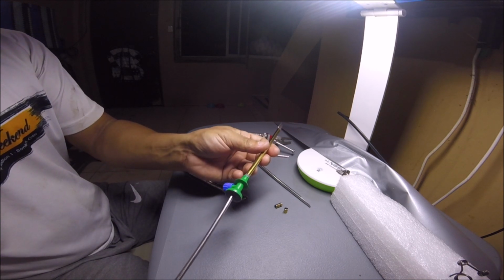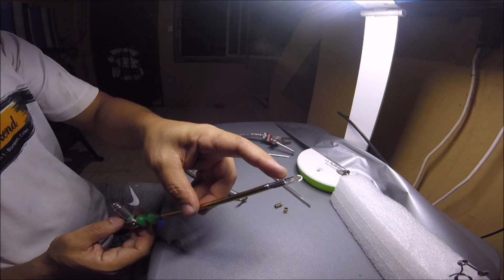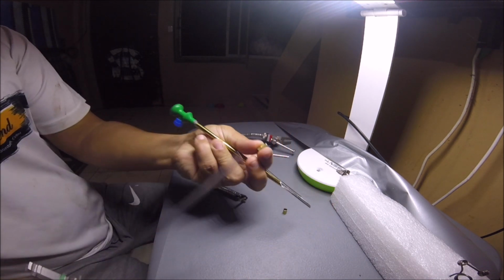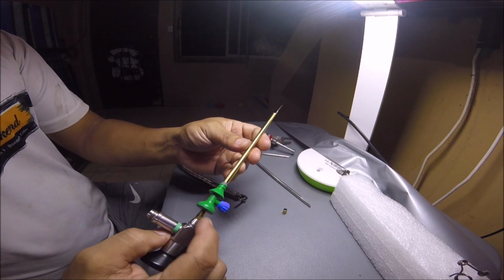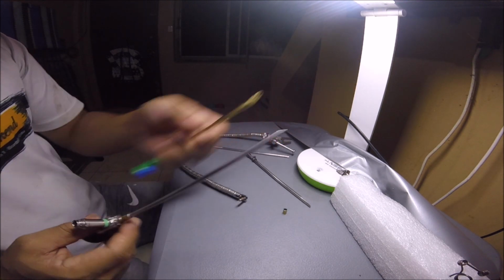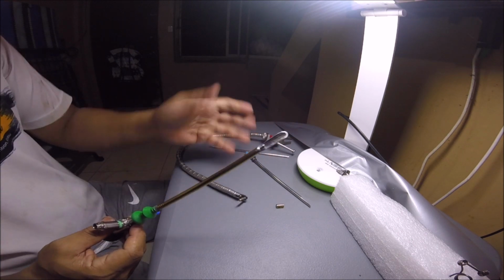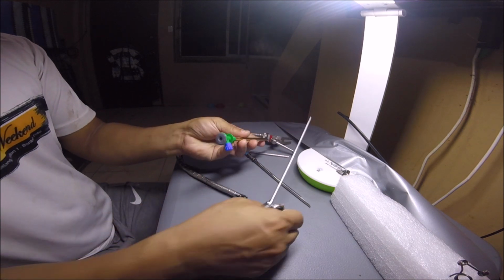So if I put this in, okay, that's flush, but you can see that the scope is outside, protruding by about 1.5 cm. But what if I wanted it to just be at that level? Well, I can always add a spacer. The spacer is really just the excess of the straw. Put the spacer in, put this in, and that serves as a stopper. And I have my tip just right there. So the tip is farther out. I have another spacer here, a shorter one. If I use that spacer, pop it in, the tip is just about protruding. I can use both. I can use either that, or something like that, or I can use it without the spacer, in which case it will be flush directly.